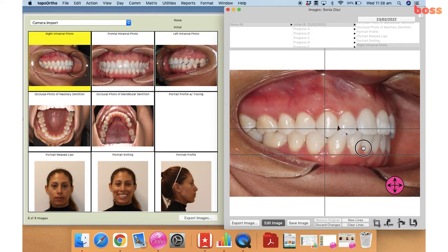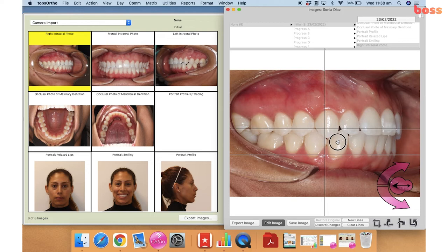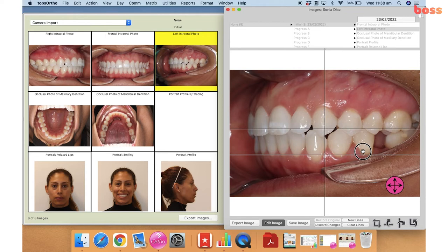With the right and left intraoral photographs, again we will zoom in. If you can get the canine in the center of the photo, that would be ideal. Here we were also able to get the full first molars and part of the second molars as well, which is good. The occlusal plane should be parallel to the floor, and we zoom in with the canine in the center of the photograph.